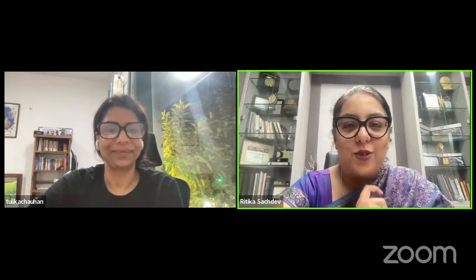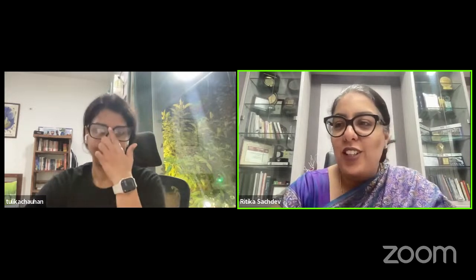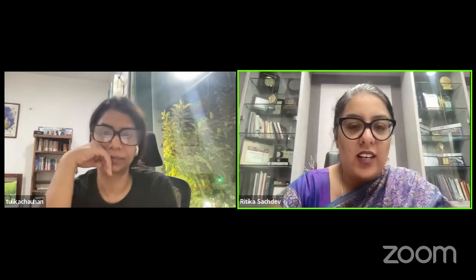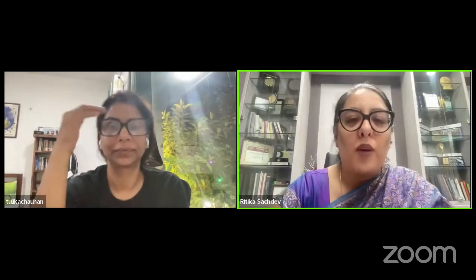So can I ask a question, hopefully to Garvita and Kanika and Kritika? So we understood that myopic LASIK and hyperopic LASIK are introducing spherical aberrations, right? So from what you've understood, if you have to do an IOL selection for a person, because this is very common now, if somebody has come who has had myopic LASIK, what IOL would be preferred, and also for hyperopic LASIK? I'll break down the question for you.